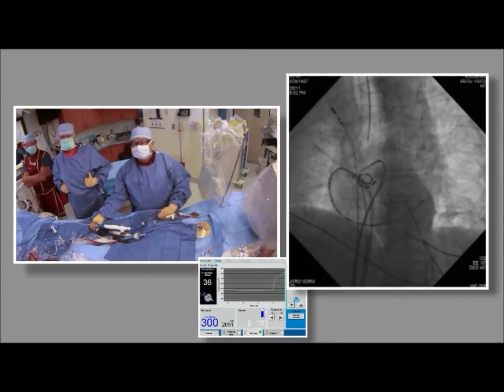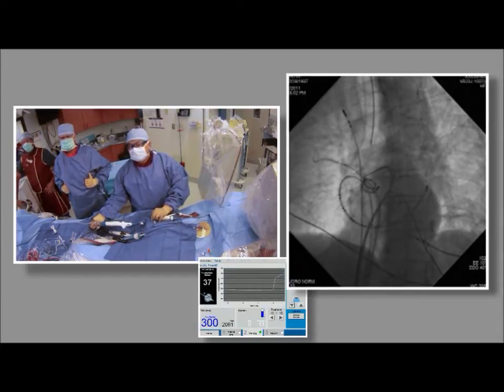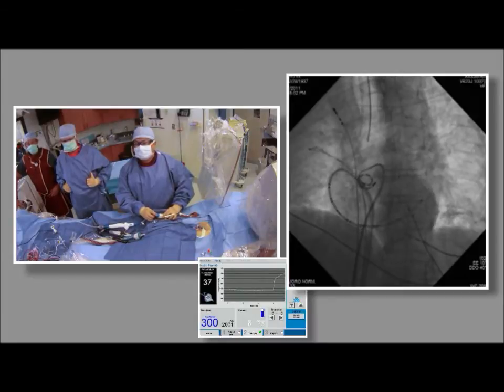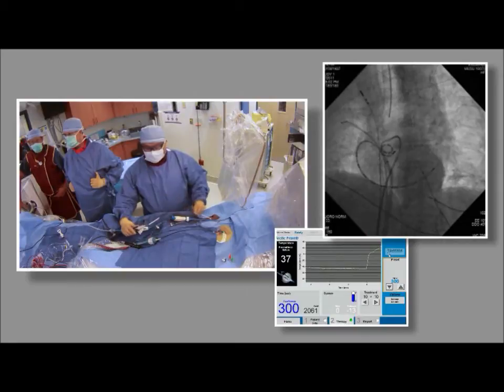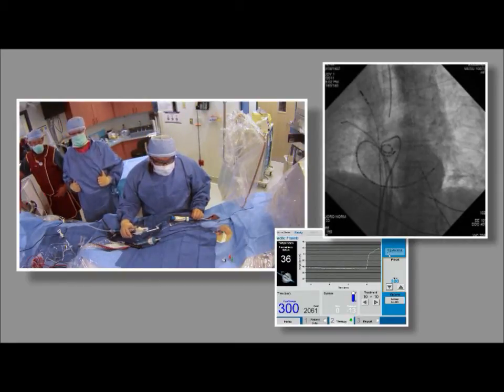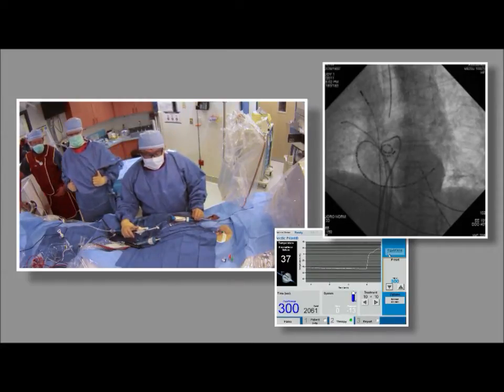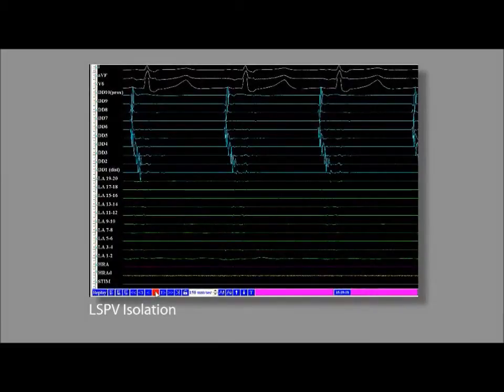That looks like a better coaxial position for the balloon. Since the spiral was frozen well there, we'll take that out. What's inside the spiral is actually all isolated. The LA signal is outside the vein, and what's inside is pretty well isolated on the inferior. That helps clean it up quite a bit. The left superior pulmonary vein is completely isolated here.